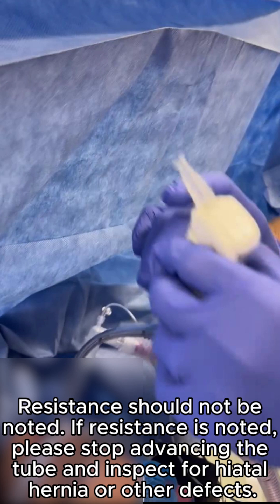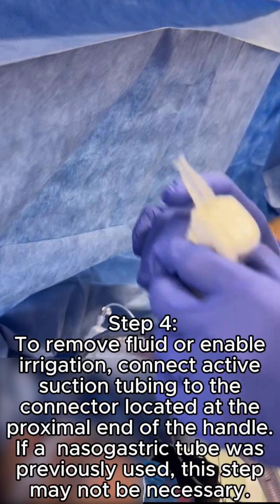Resistance should not be noted. If resistance is noted, please stop advancing the tube and inspect for hiatal hernia or other defects.